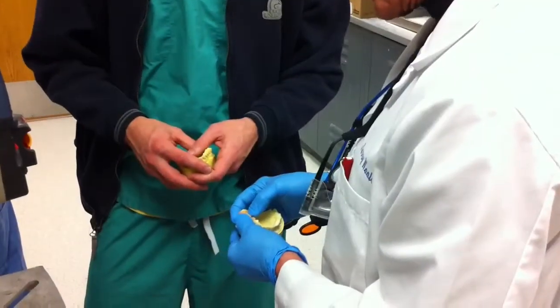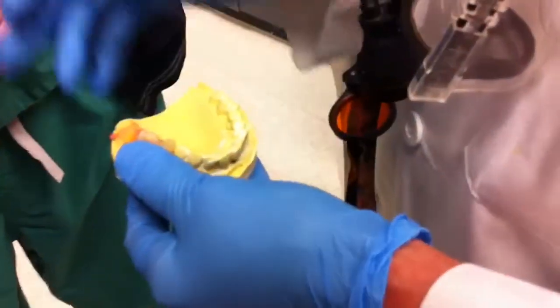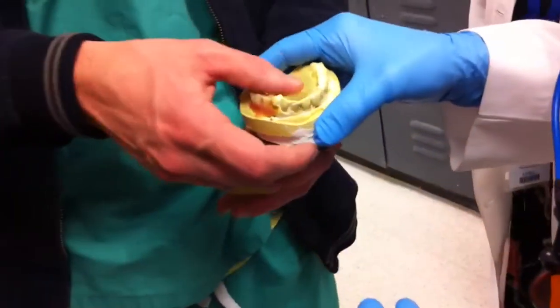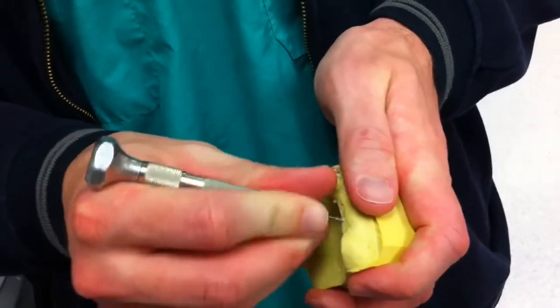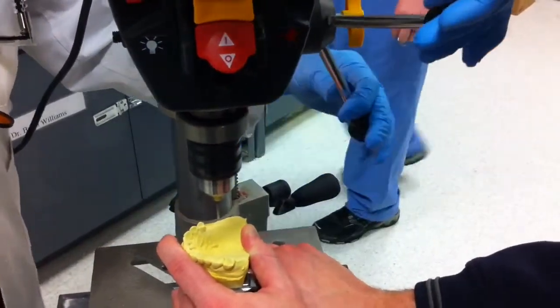Look right in the central pit, central fossa of both of those, and then transpose that over to that edentulous ridge and let's make a mark. Go down in each hole just a little bit, and then we'll come out just to verify.